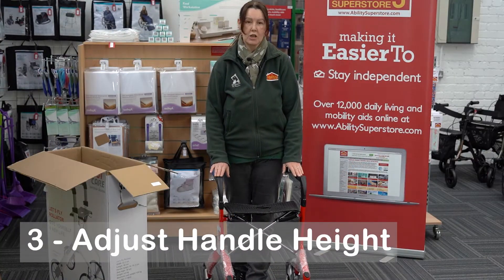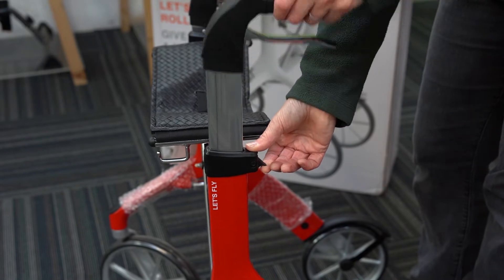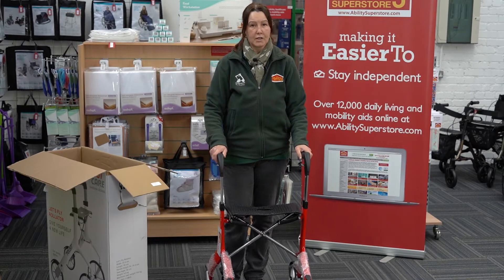Once you've opened it up, you might like to adjust the handles to your height. It's very simple - just lift this button up here, pull it to the height required, and you'll hear it click into place. Same on the other side - there we go, it's ready.